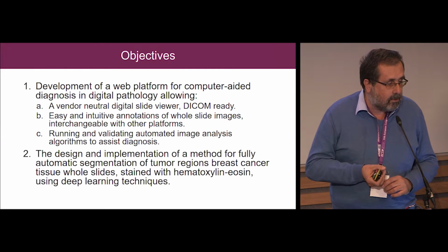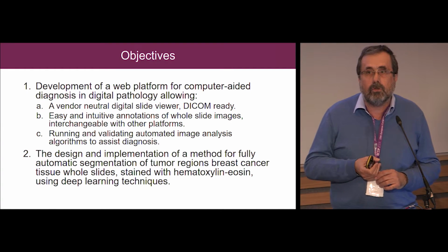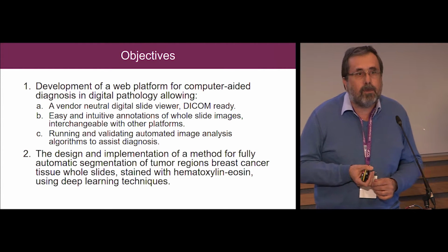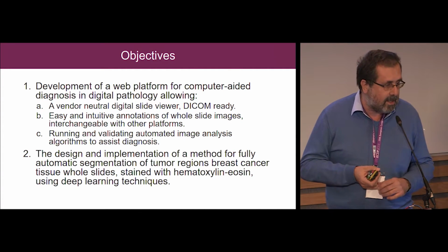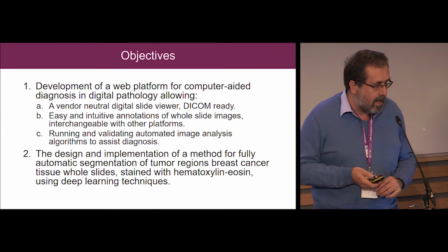So this is a neutral digital slide viewer. And another main objective was that making an annotation should be very easy, because these annotations are not only done by pathologists, but also by very well-trained technicians. And then we had, of course, to validate the results of these deep learning algorithms.